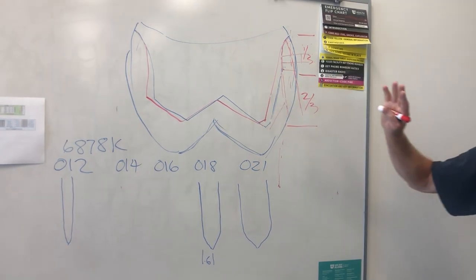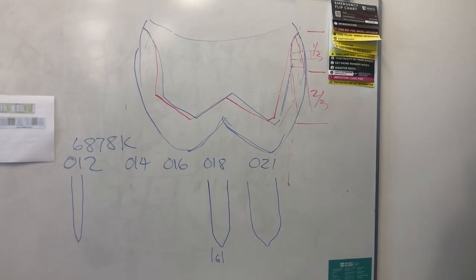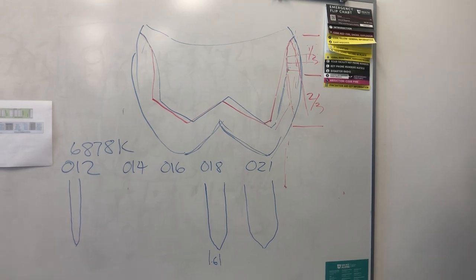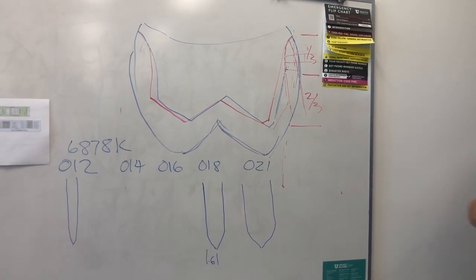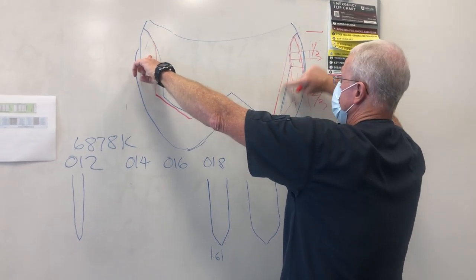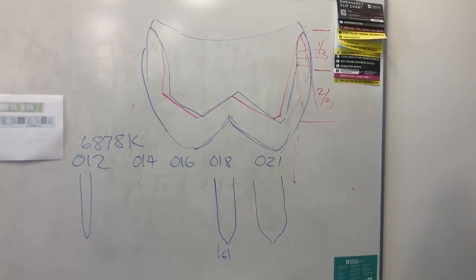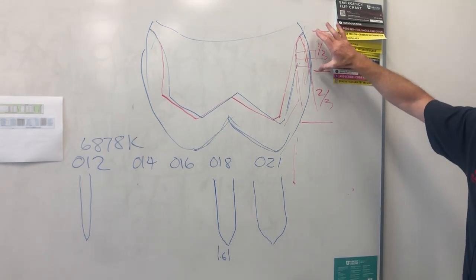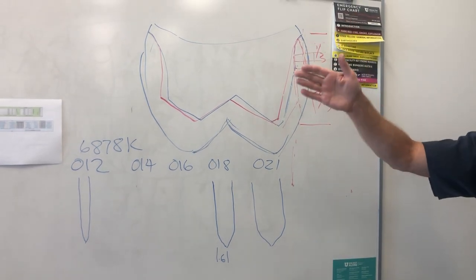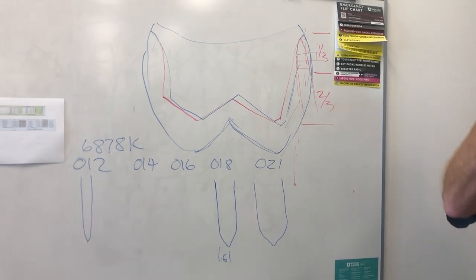It's a subtle change. Don't get too aggressive with that change and put a real steep angle in there, or what are you going to do to your taper overall? Because it will have an effect on resistance and retention. And even though you're maybe very parallel between here and here, if this is a real sloped second plane, you've lost it. So we're going to look for where you place it and have it be very subtle. With these Typodont teeth, it is not an aggressive angle change. It is a subtle angle change.